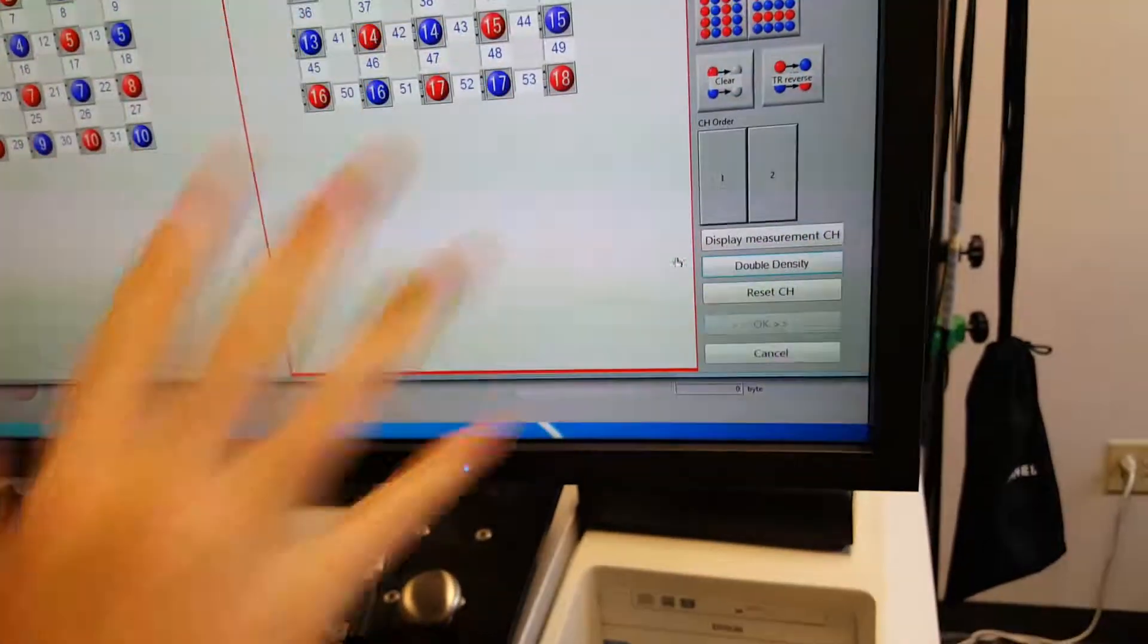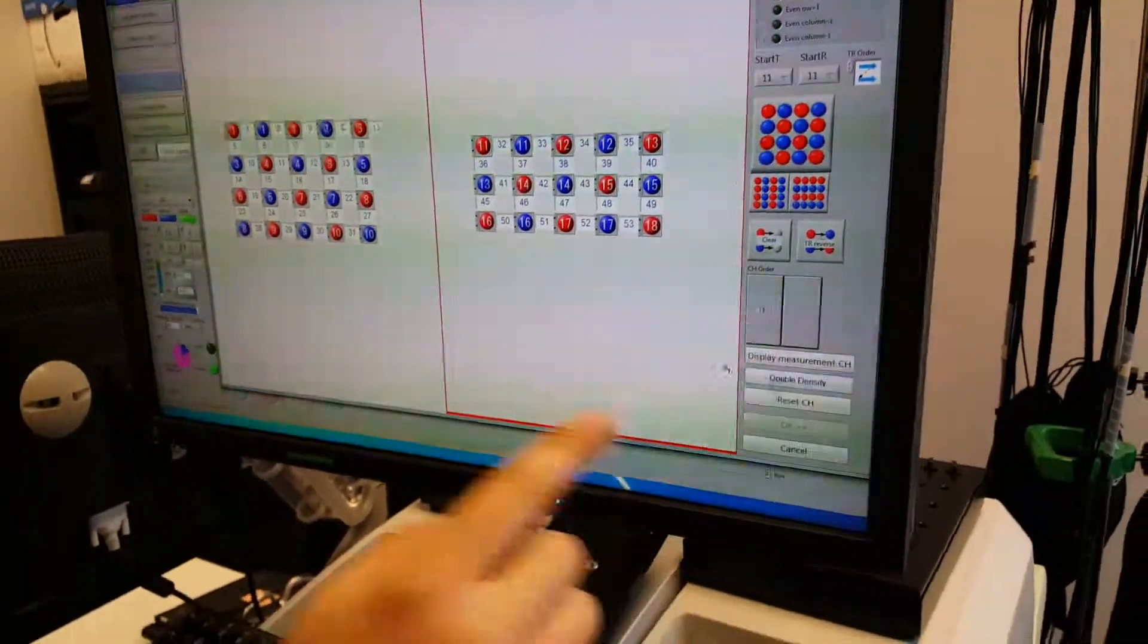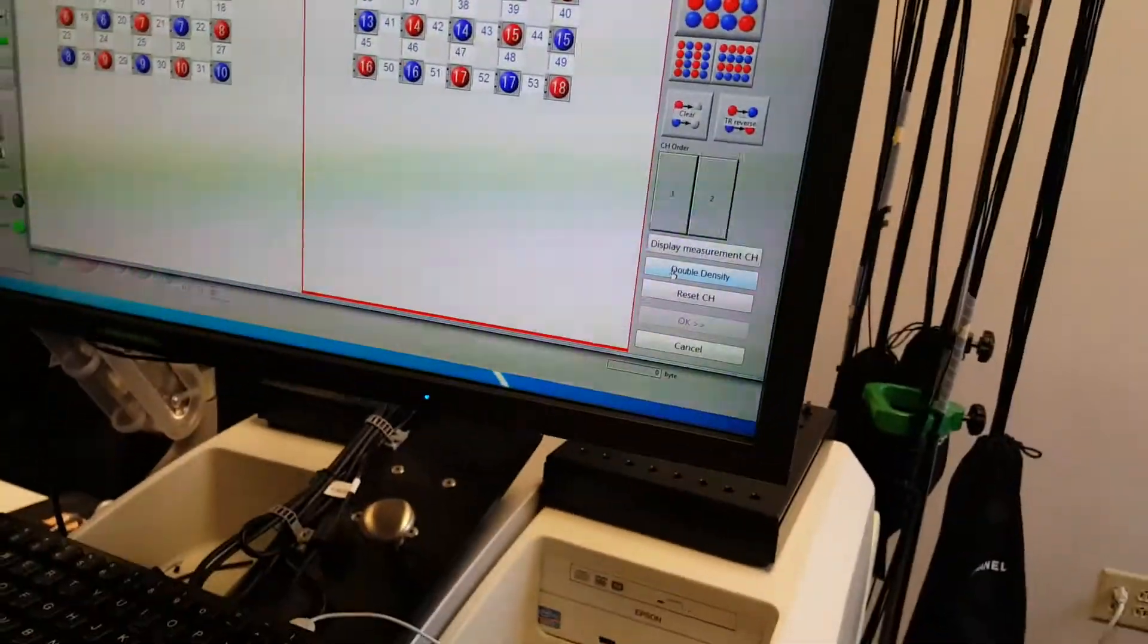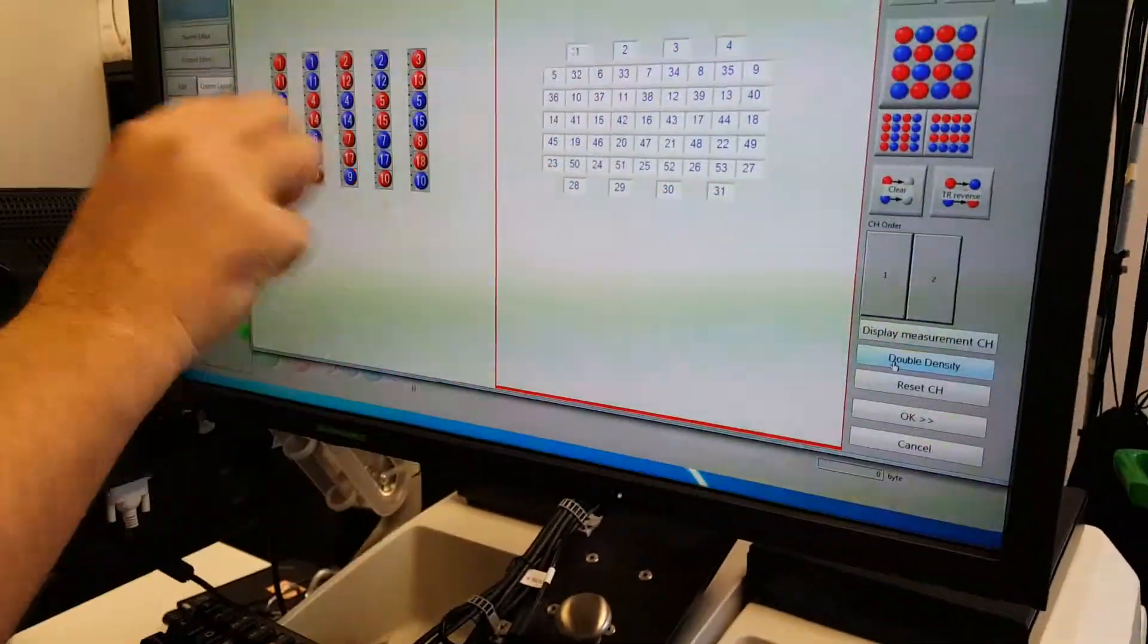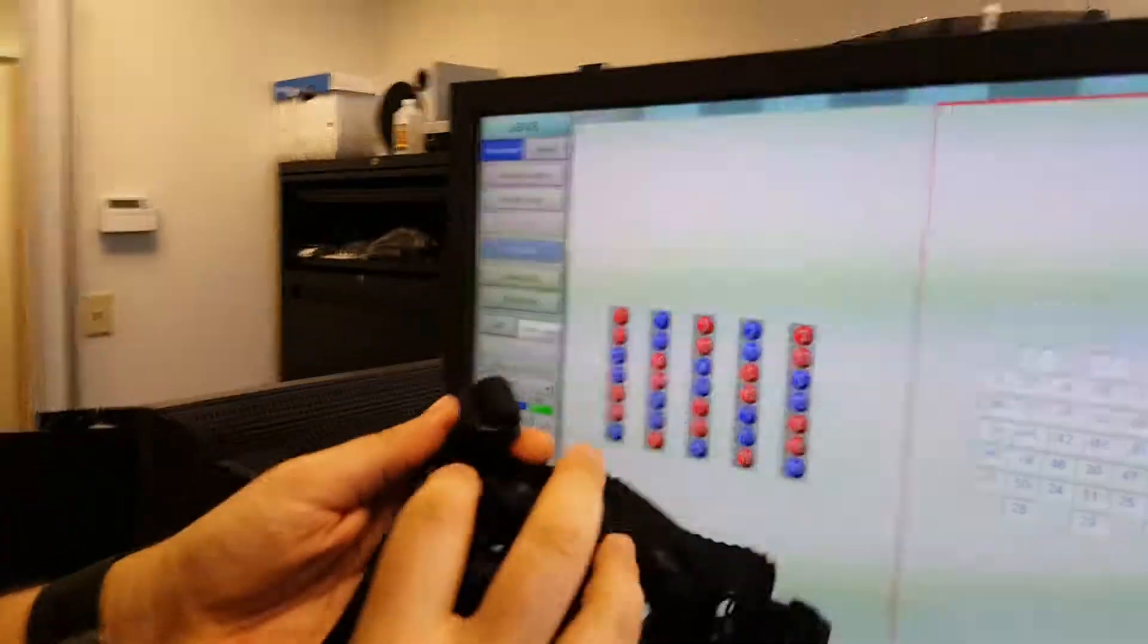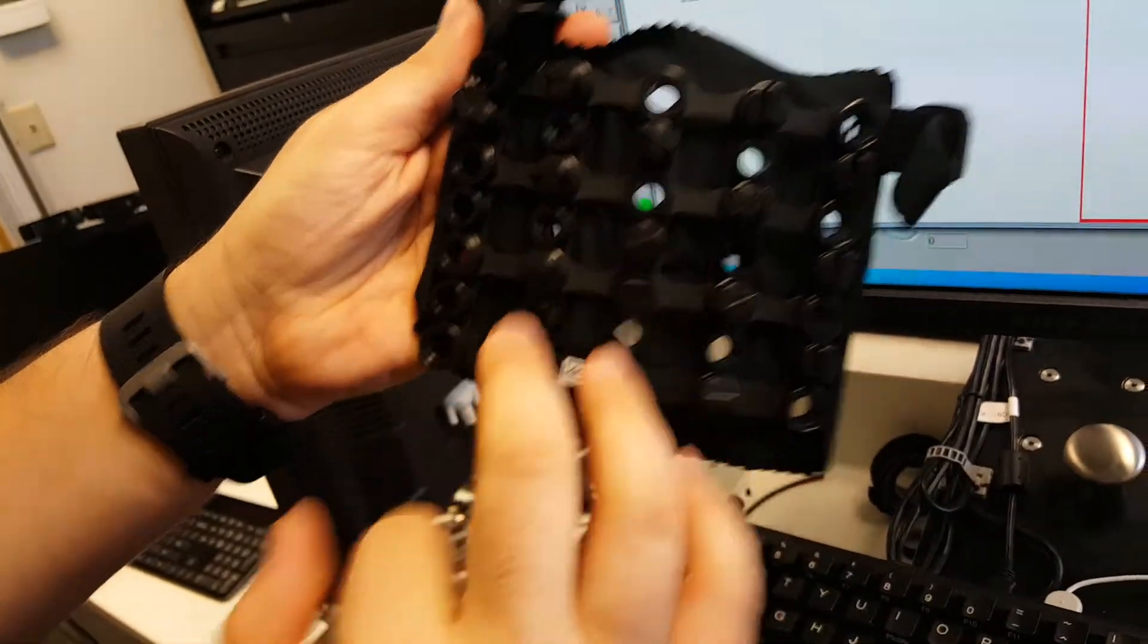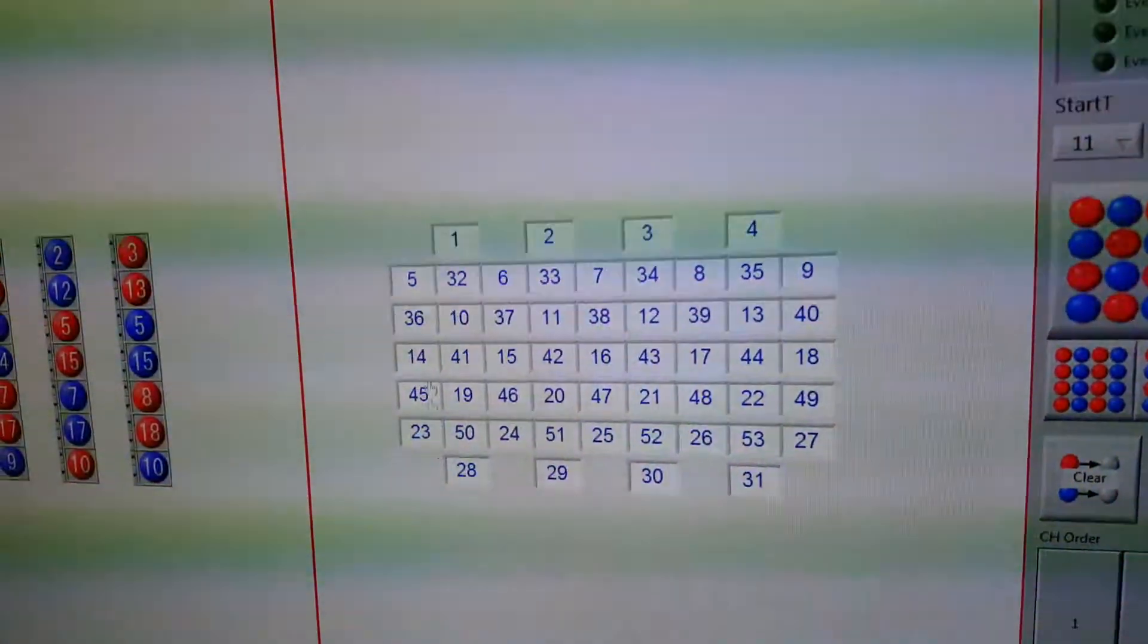And it defines all the channels where they should be normally. Now once I do that I can calculate the double density channels. So I click this and what you'll see is now it moves the orientation of the optos, so it's red red blue blue red red blue etc.